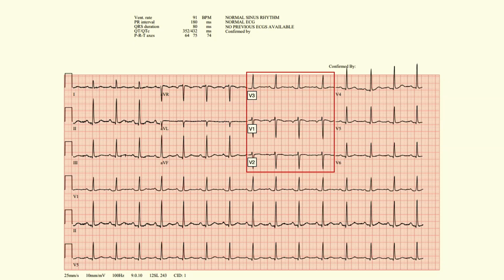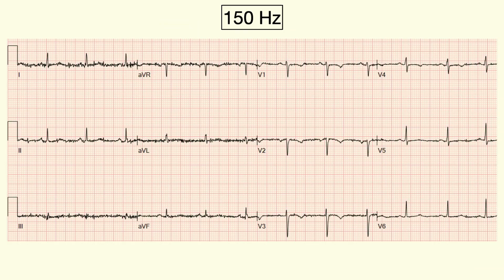This was happening for months, and I kept seeing these ECGs with this weird 3-lead swap, V1, V2, V3, and it was driving me nuts. And I eventually figured out that literally the ECG machine in our clinic had the cables plugged into the box wrong. So the nurses were applying them to the patient correctly, and then the cables were getting swapped in the box, and we were systematically producing ECGs with swaps anyway.